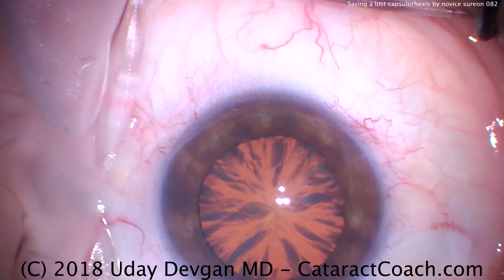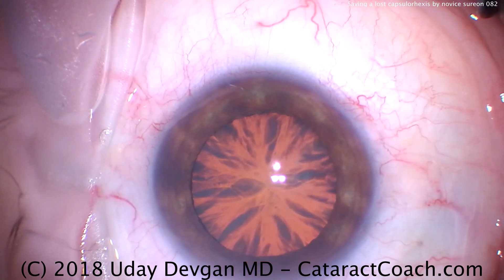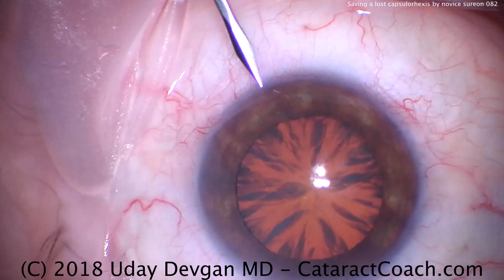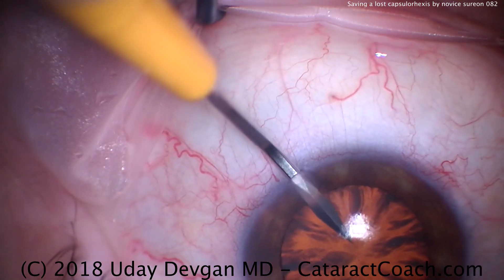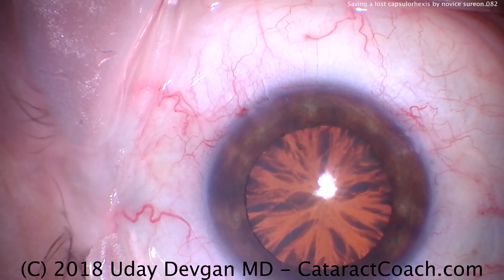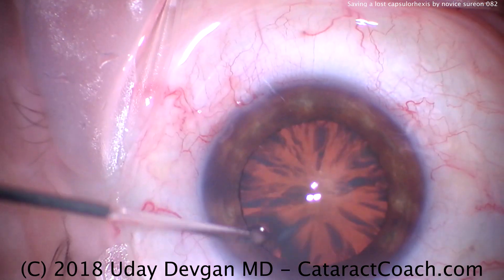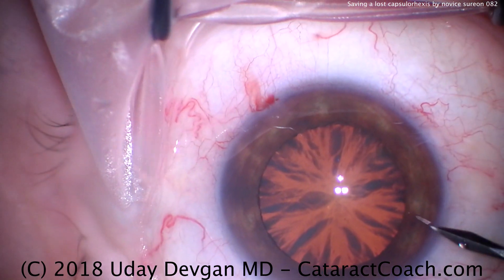This is cataractcoach.com with a resident case learning how to do a capsulorhexis. You'll see something a little different here. This is me, the attending, making the extra paracentesis incision. And then the resident, who's just learning and is a novice, is going to learn how to do the capsulorhexis.